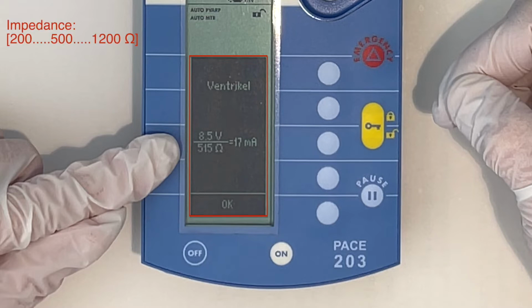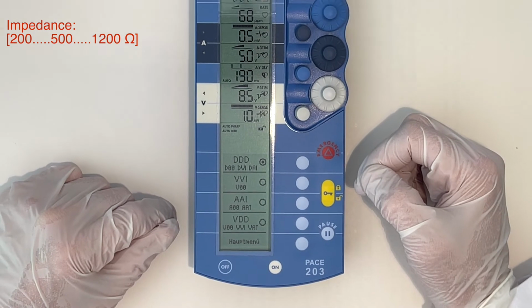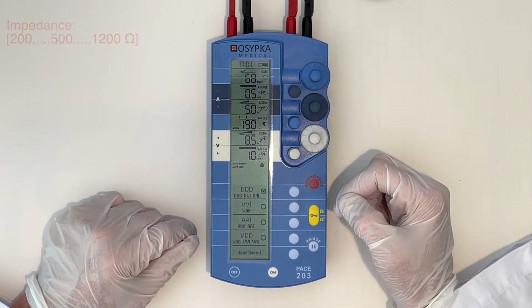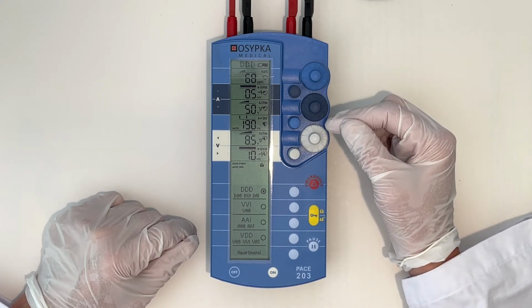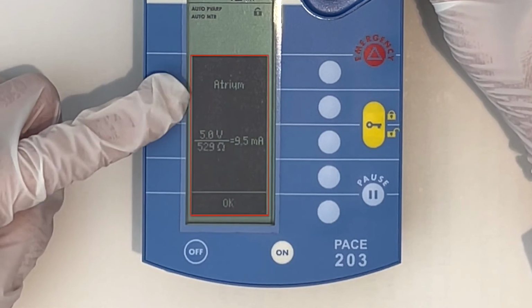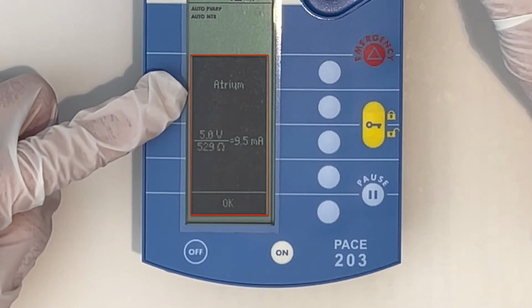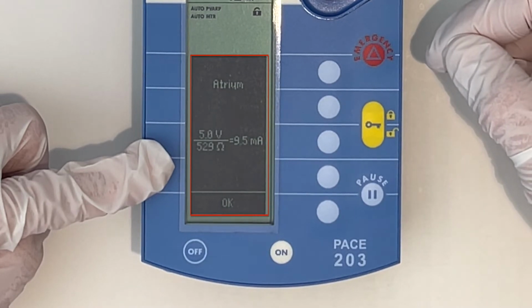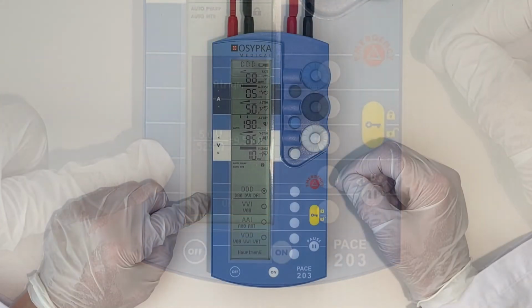An impedance value of approximately 500 ohms is desirable. A value in the window between 200 and 1,200 ohms is still acceptable. The impedance in the atrium can be measured in the same way. So if you have a problem with sensing or the stimulus threshold, turn the control for atrial stimulation amplitude briefly. And the display shows atrium, and under the fraction line again, the measured impedance, this time in the atrium.